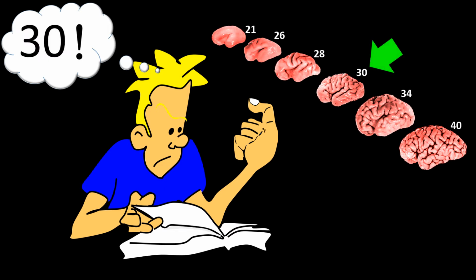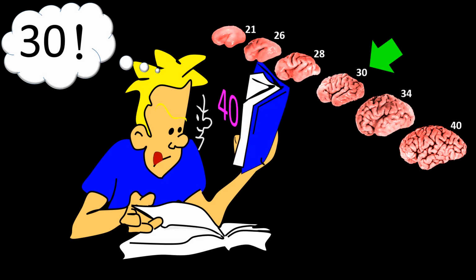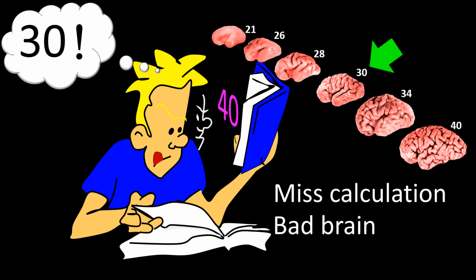And then, once an unbiased brain age has been attached to the record, to check the conceptual age provided by the obstetrician. If they do not coincide, either the conceptual age estimated by the obstetrician is wrong, or there is something wrong with the neonatal brain.